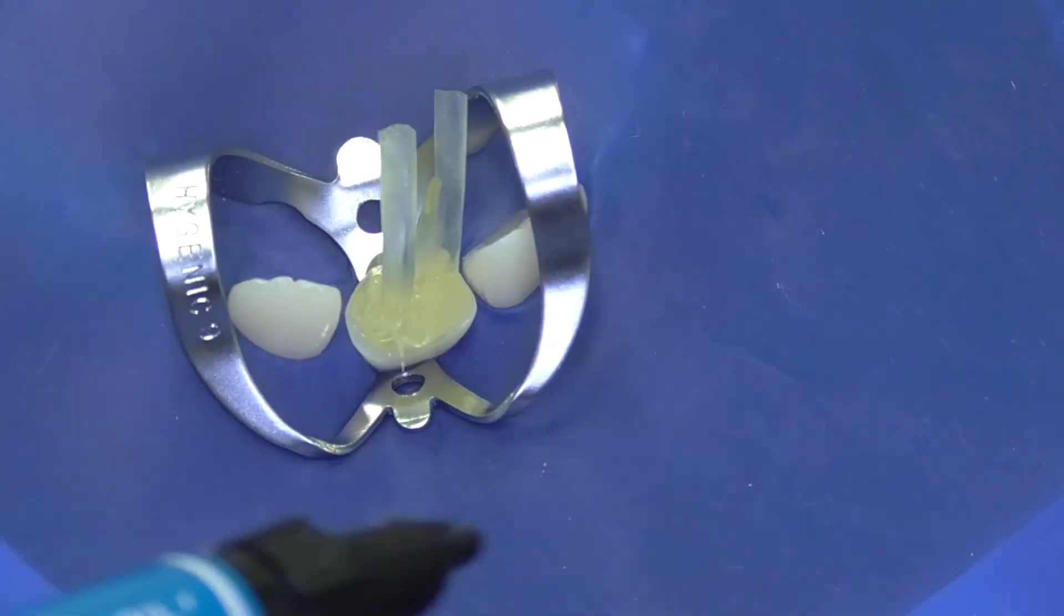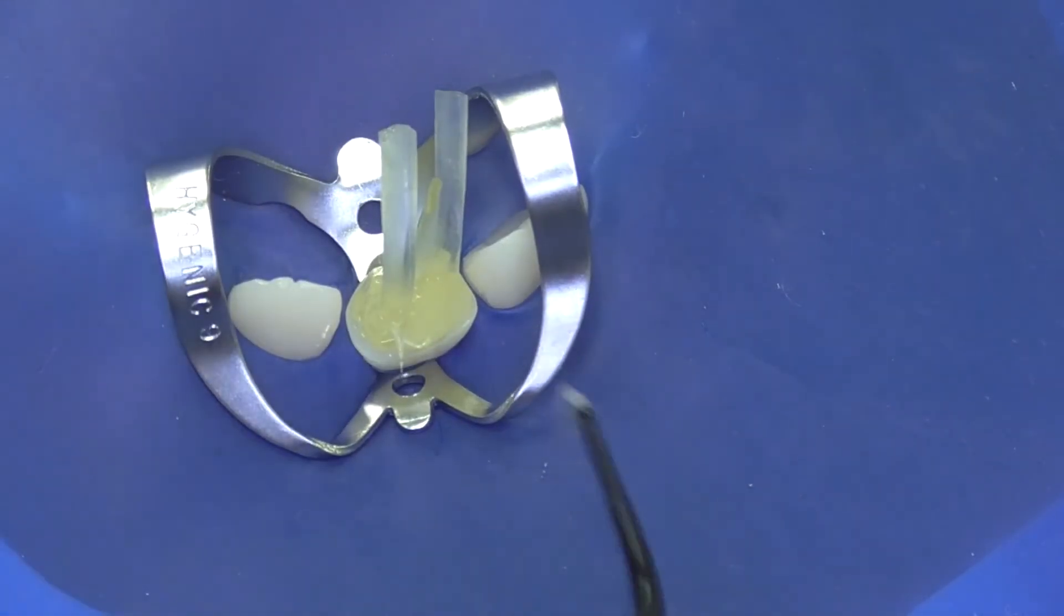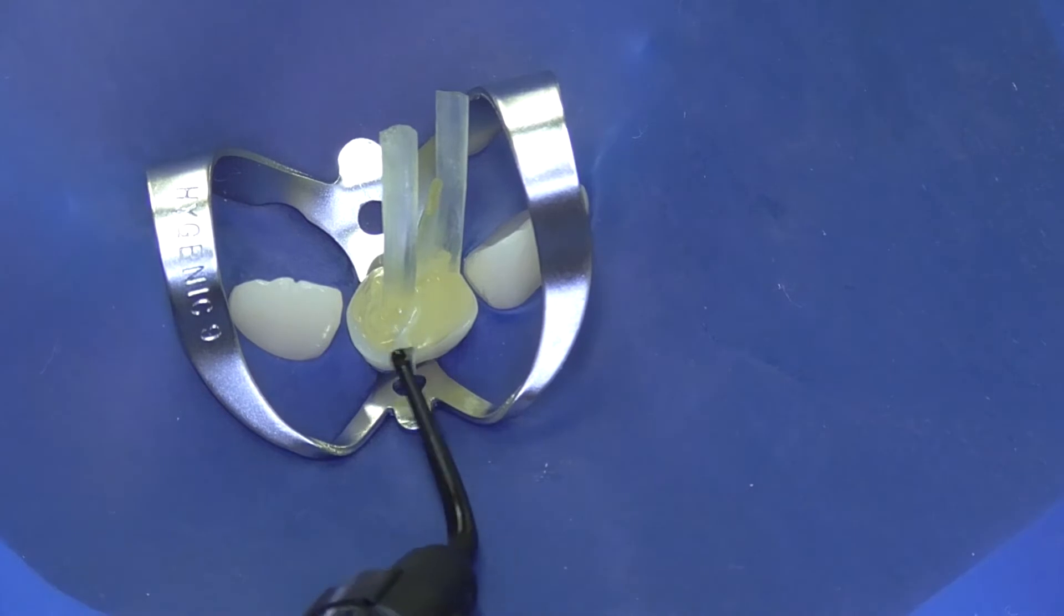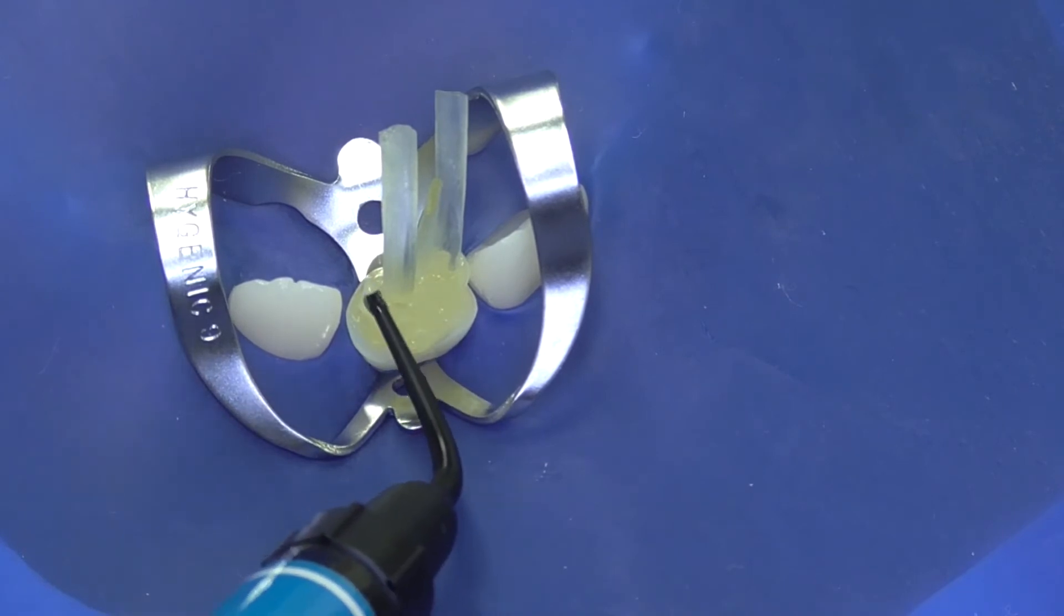Curing depth of bulk shade EverX Flow is five millimeters, which means that curing of the core can even be made at once.